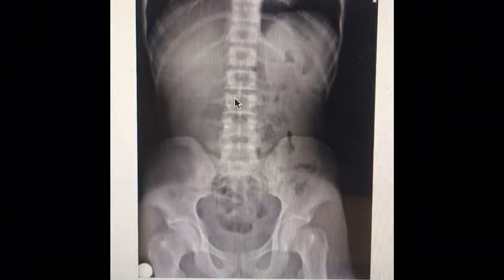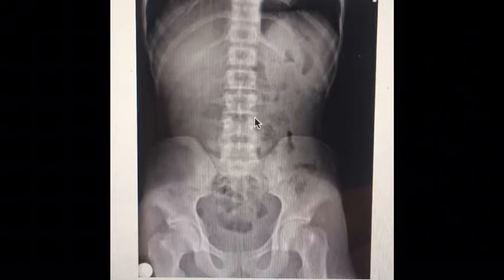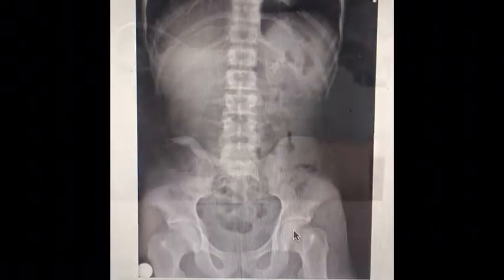Once we have made sure all of our equipment is working properly and the patient is undressed and put on a gown, we're going to take our scout image. Our scout image is taken before the exam to make sure there are no artifacts, and we're looking for body structure and their anatomy, and we're looking for any abnormalities within the GI tract. We're also looking to see how well their cleansing process went with the cleansing kit.